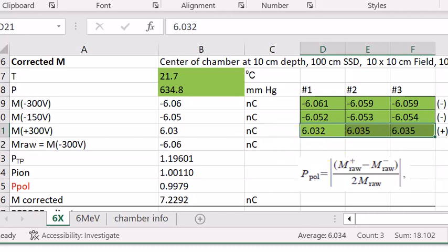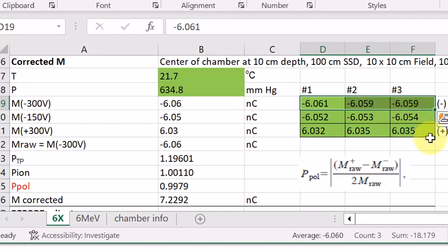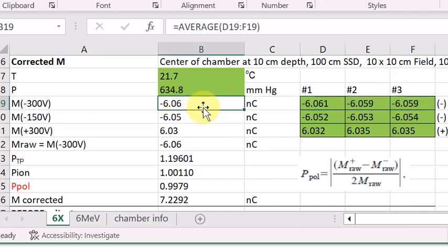Then we keep the chamber at the same location, but only changing the bias to negative 300 volts. We again take three measurements, they average to about negative 6.06 nanocoulomb.